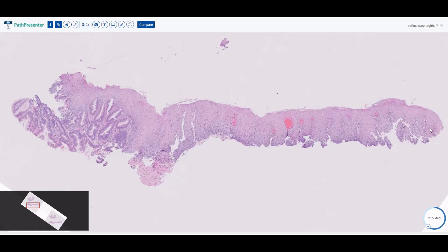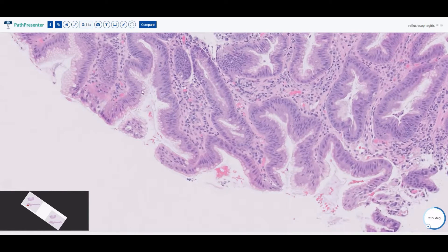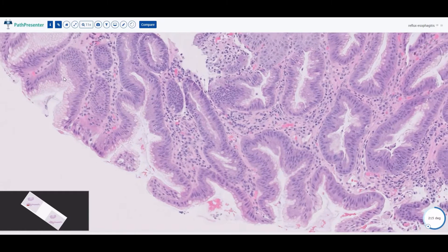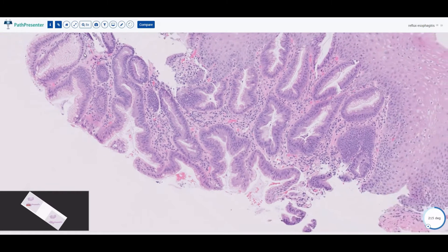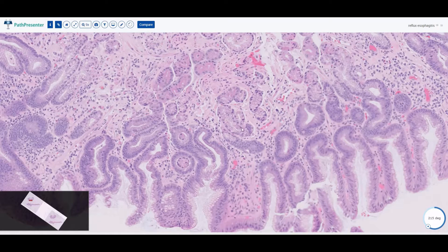As you can see here we have some squamous epithelium with some lamina propria, so all together squamous mucosa followed by glandular mucosa. The glandular mucosa has this very pink apical mucin which makes it foveolar epithelium, so this is a portion of stomach commonly known as the cardia, which is the portion of stomach at the junction with the squamous mucosa at the gastroesophageal junction. Cardia-type mucosa usually has antero-type mucosa, meaning they have mucin glands and it's not really acid-secreting.